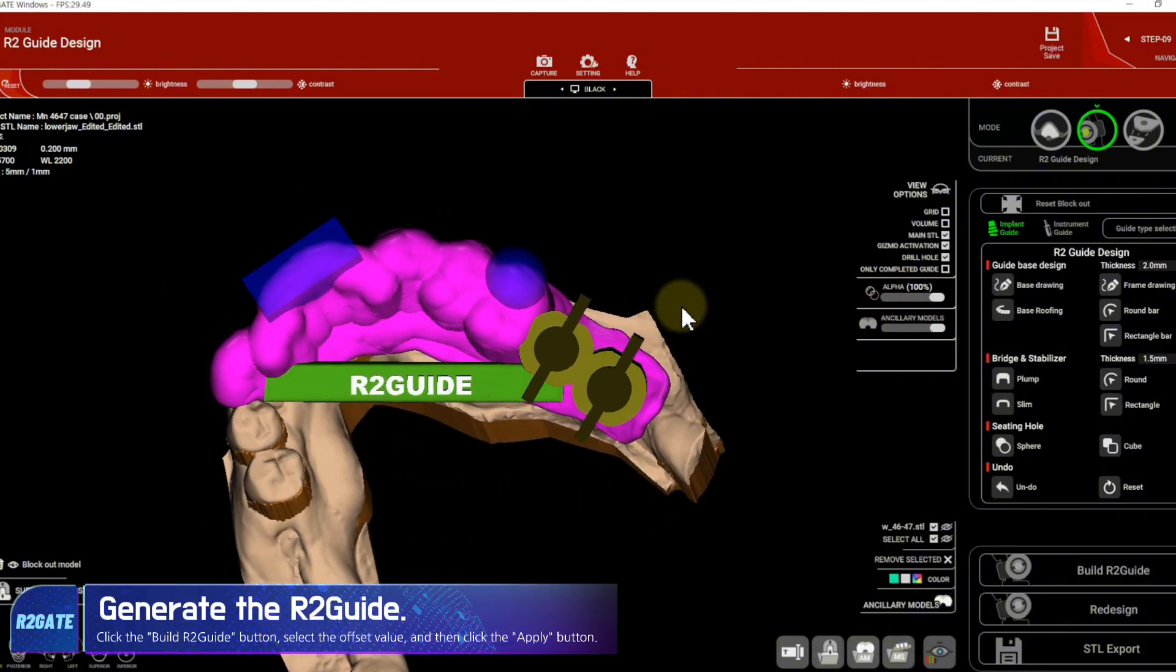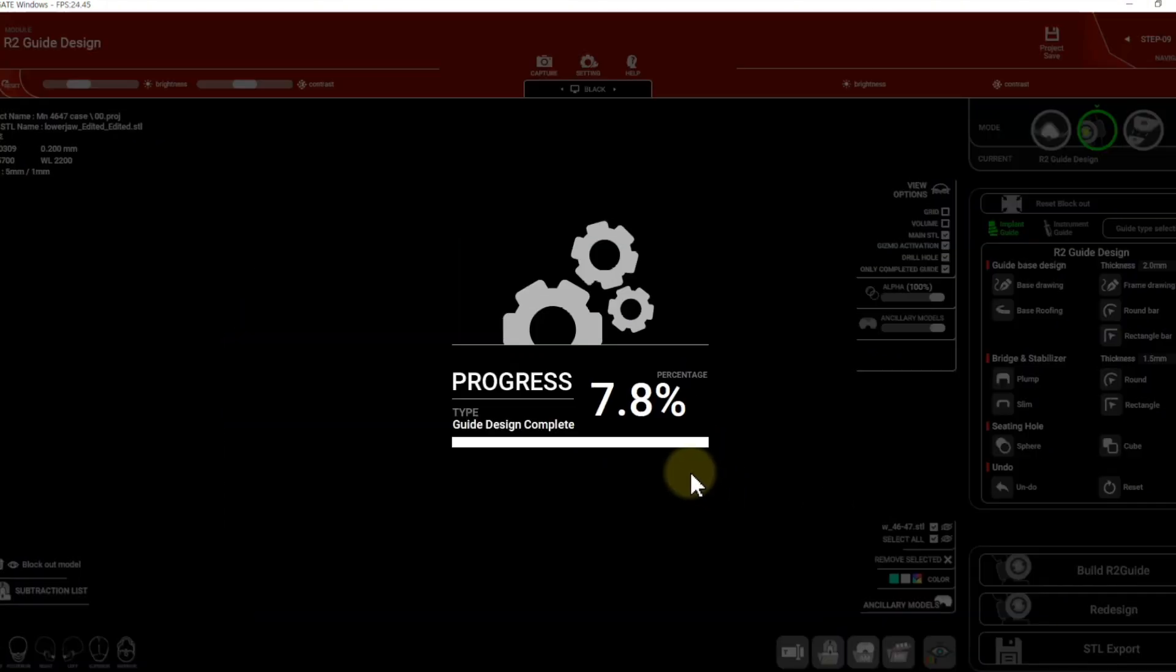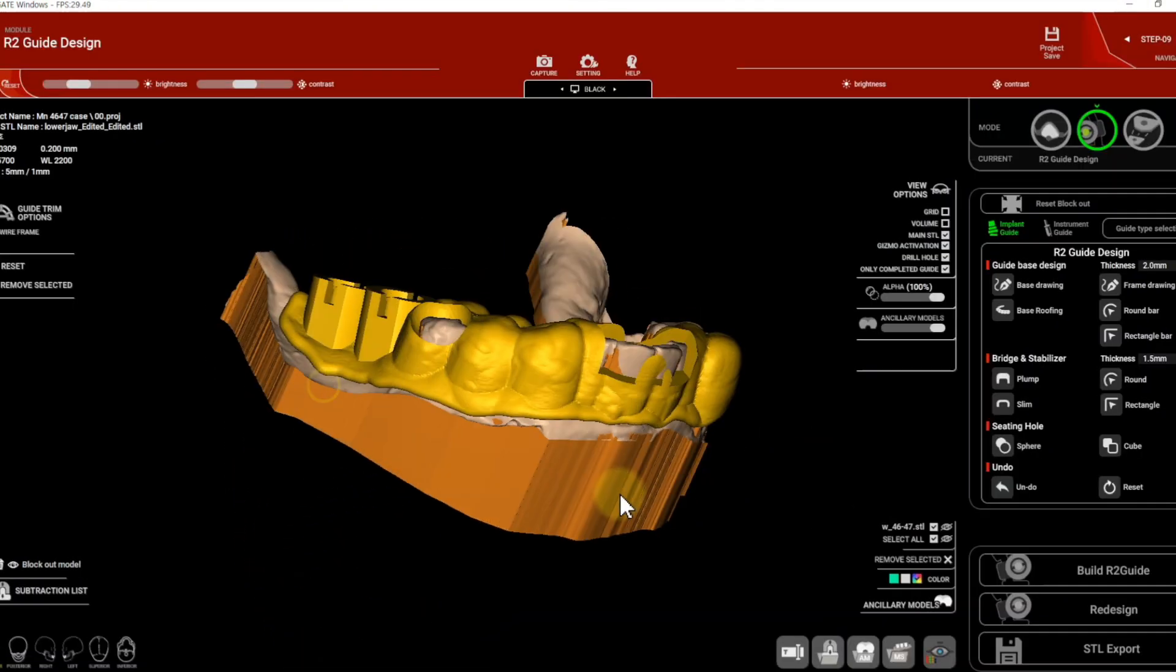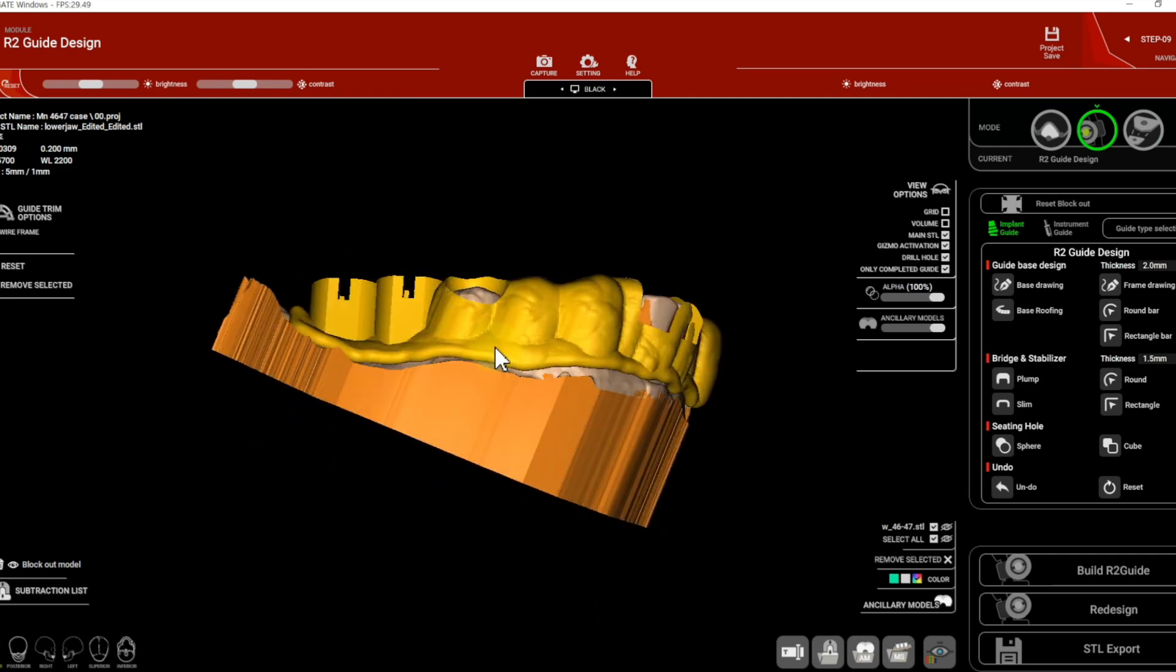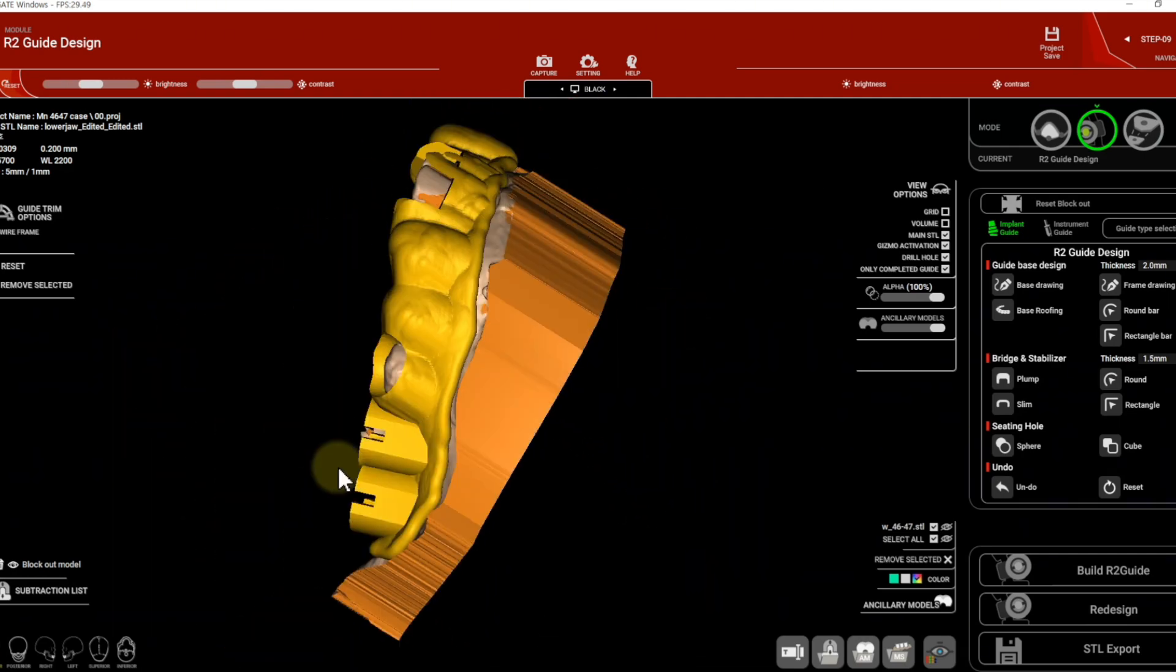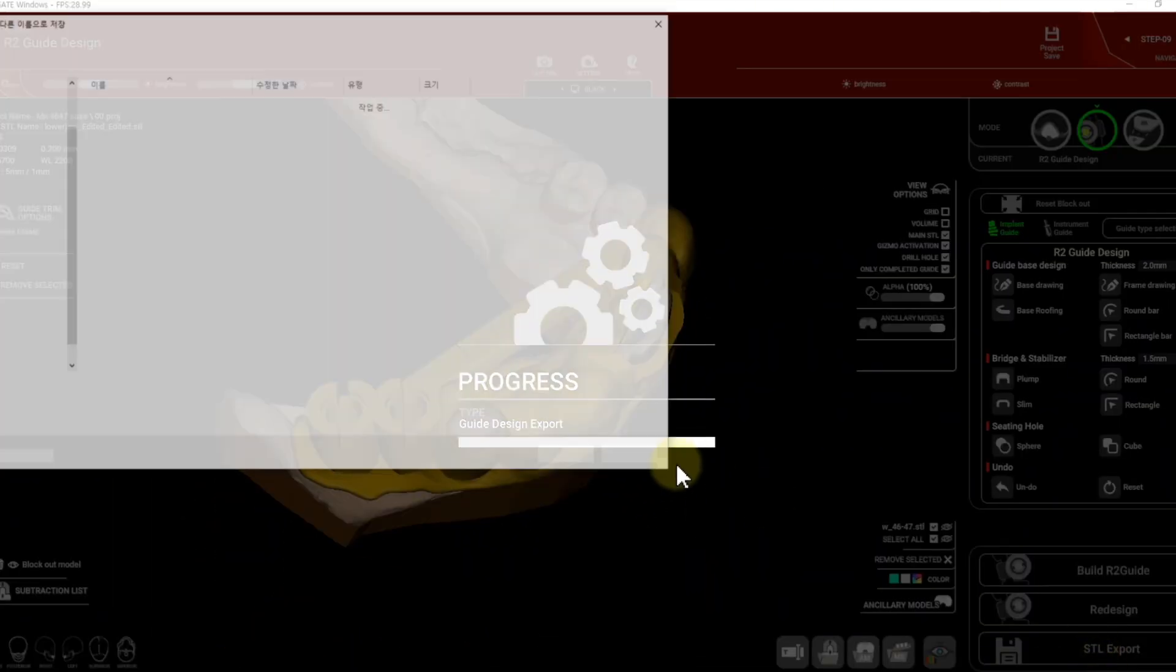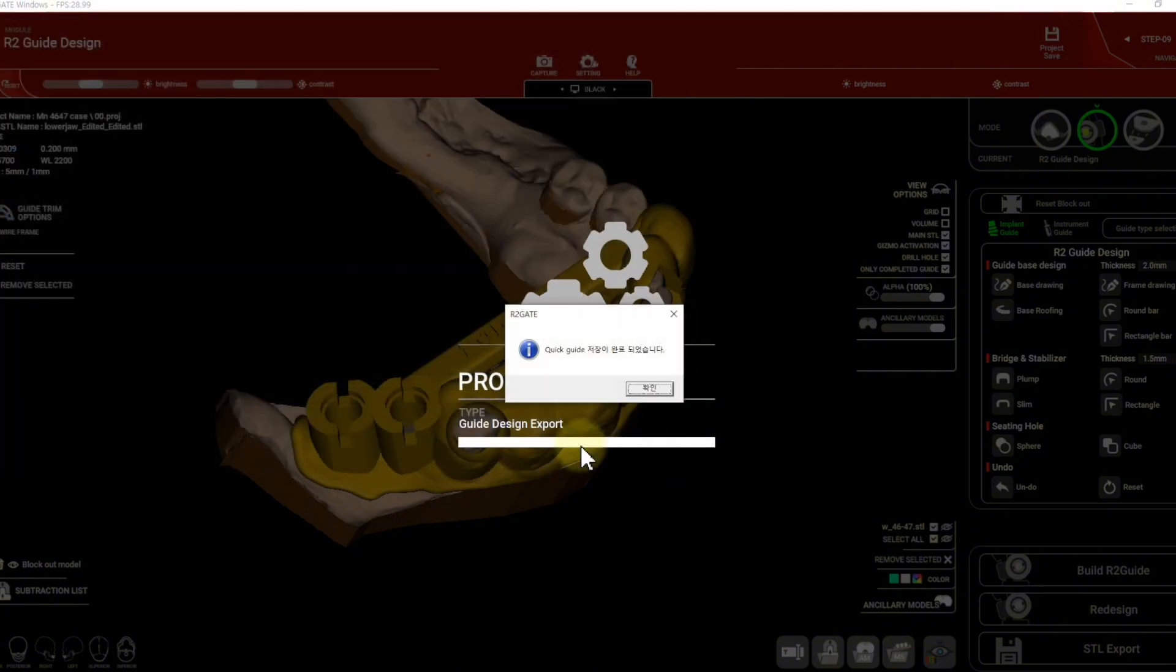Click the Build R2Guide button, select the offset value, and then click the Apply button. Select the training button.